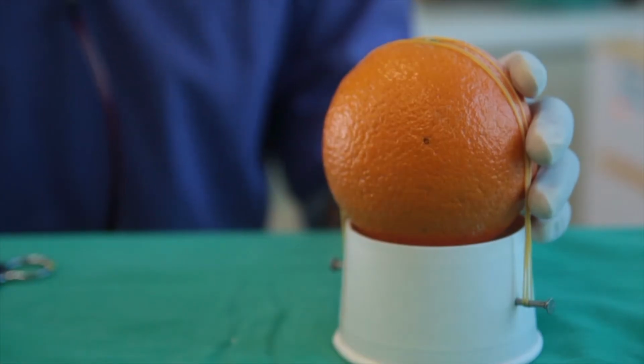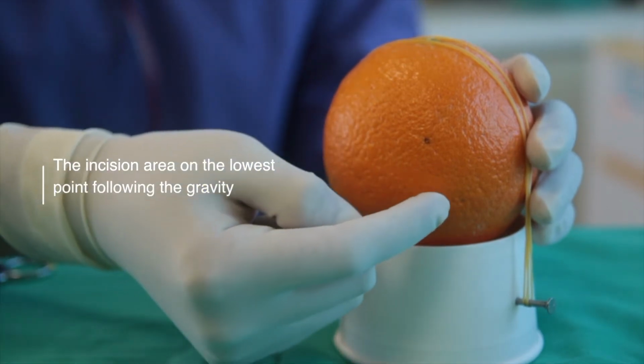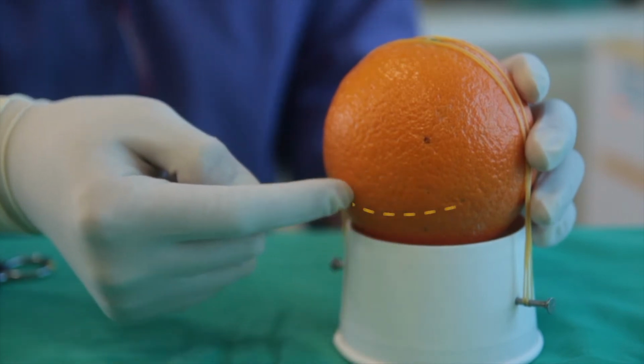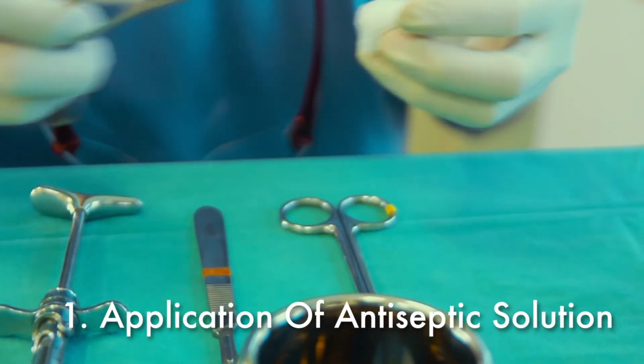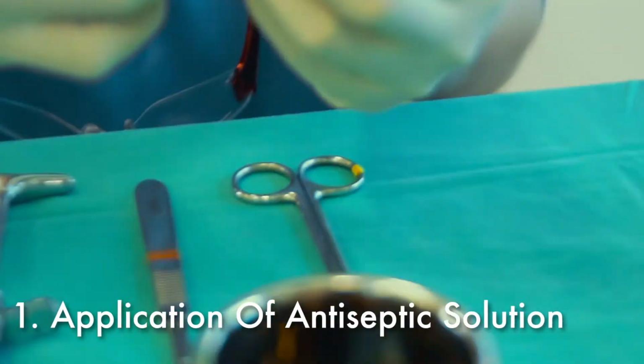Before we start the procedure, we have to pick the suitable location for the incision, which is the lowest point following the gravity. Usually it will be around this area, to make sure the pus can flow accordingly. Then we start off by putting the antiseptic solution on the skin, which is the povidone, with the help of your assistant.